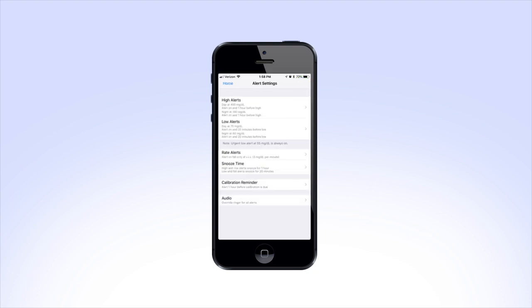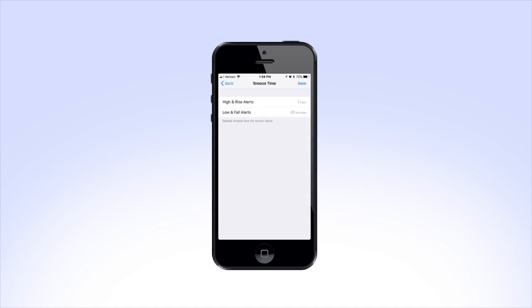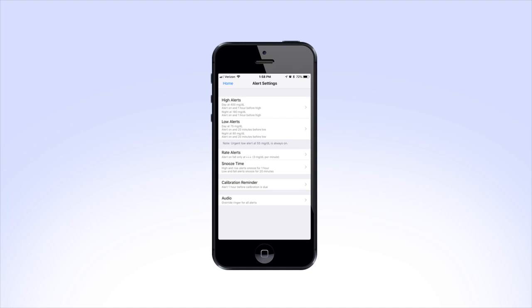Alerts can also be snoozed using the snooze feature. To change the default snooze time for high and low alerts, tap on Snooze Time and choose either High and Rise Alerts or Low and Fall Alerts to select the time you'd like these alarms to be snoozed, and tap Save to save your settings.